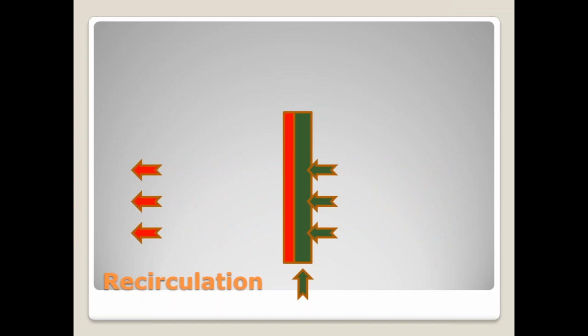Usually, if we need to put two cannulas, one in IVC and one in SVC, what I do is convert the right femoral cannula, which is 29 French, into a return cannula. I push it further up and put it in the mid RA. I put another cannula of 21 French in the opposite femoral vessel, and I keep the jugular cannula as a drainage.